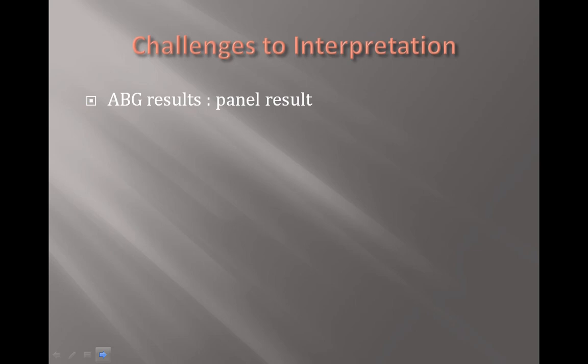Of all the labs we get reported back to us as critical care nurses, I think the ABG is one of the more challenging to understand, primarily because it's a panel result, and it demands that you look at all the elements in relationship to one another to accurately assess what's happening with your patient. If you put the pieces together correctly in context with your patient's condition, you'll be on the road to selecting the most appropriate treatment option.